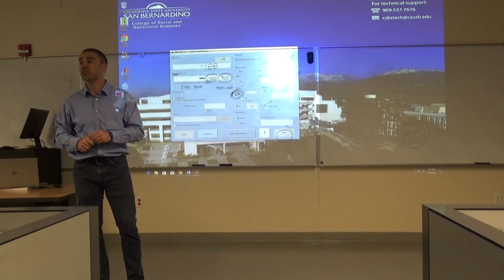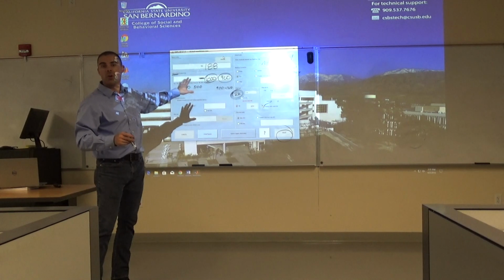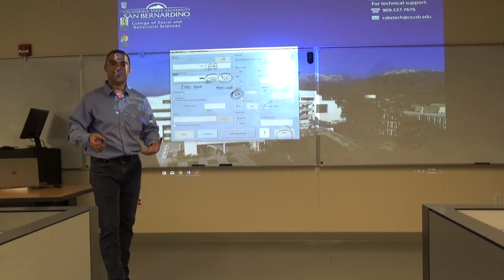And please raise your hand and ask questions if there's any trouble or error messages, if you can't get here or get it to work. We will slowly but surely work through it and come to some solutions.